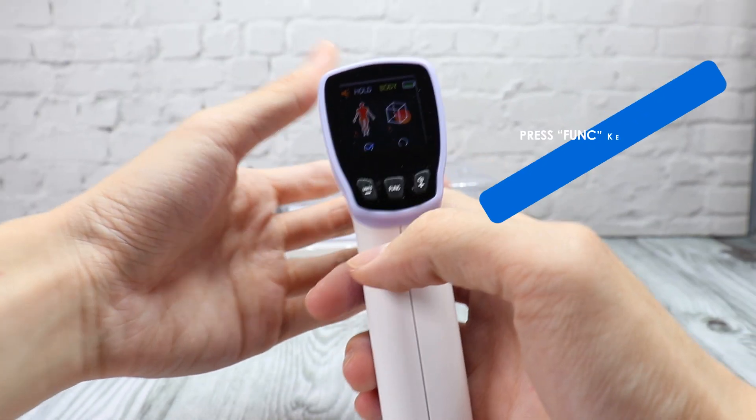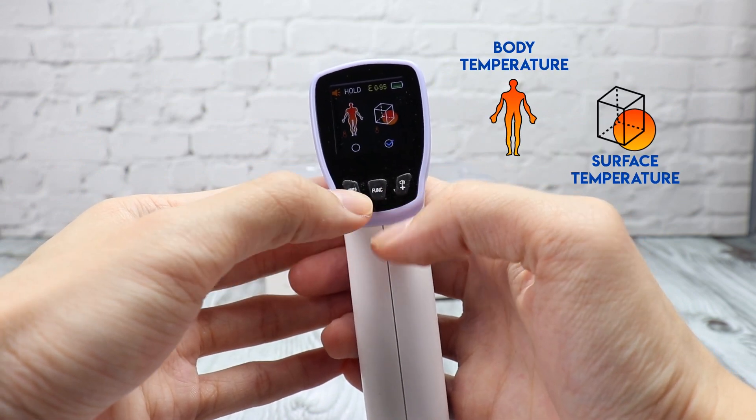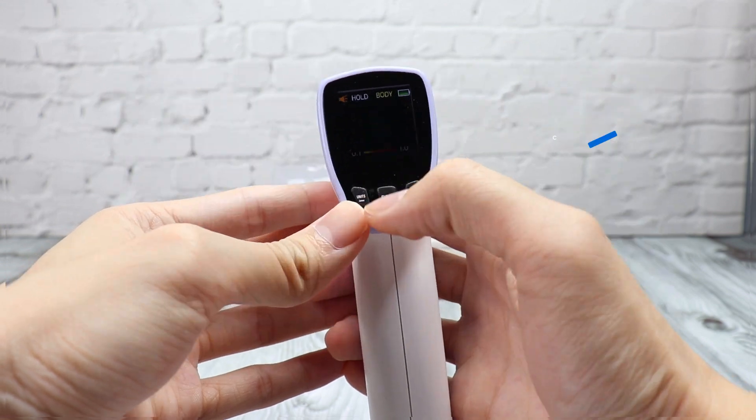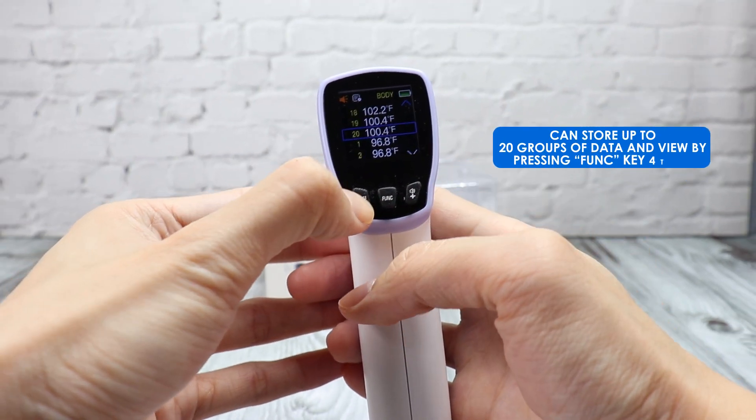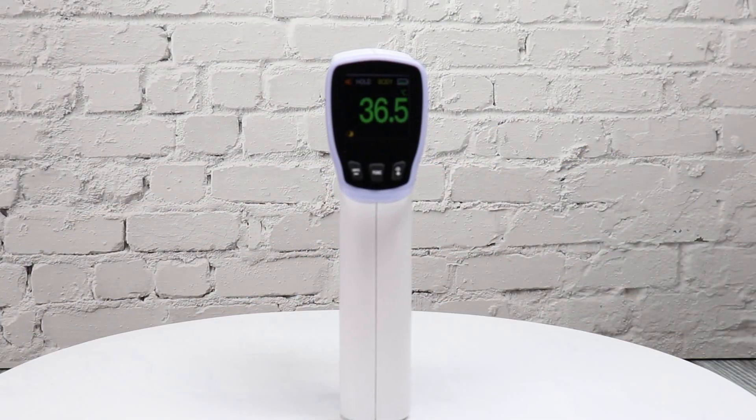Press the function key to enter the measurement mode selection. You can select body or surface temperature. To view the stored data, press the function key four times. You can store up to 20 readings. Pull the trigger to return to the measuring mode.